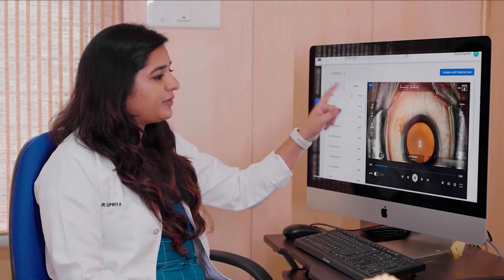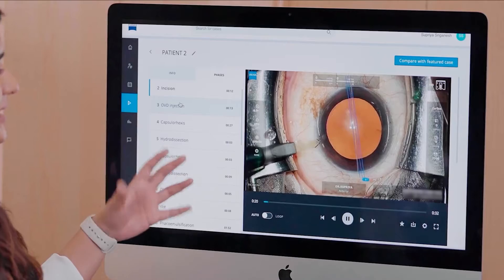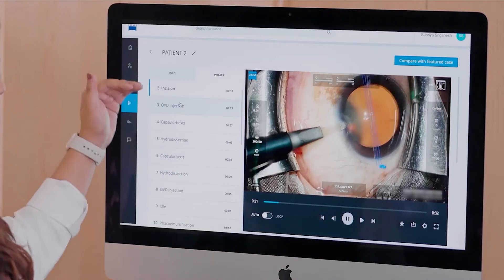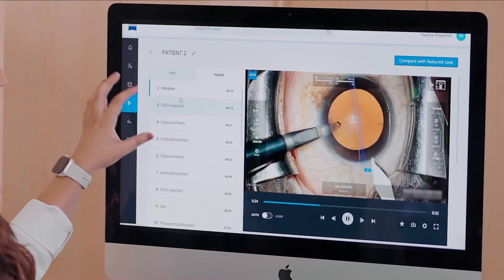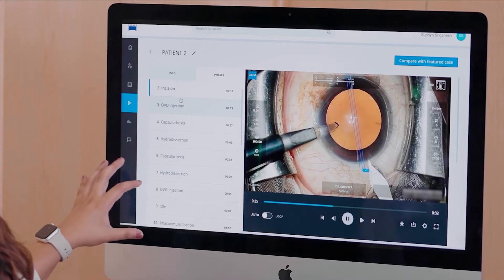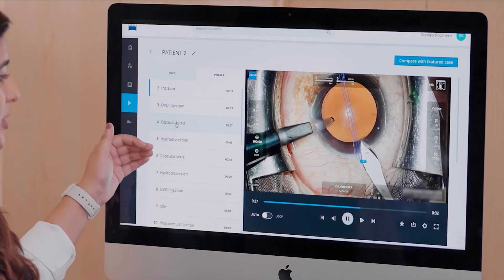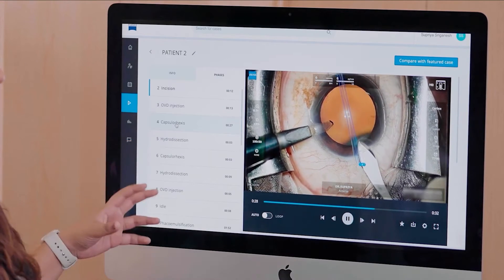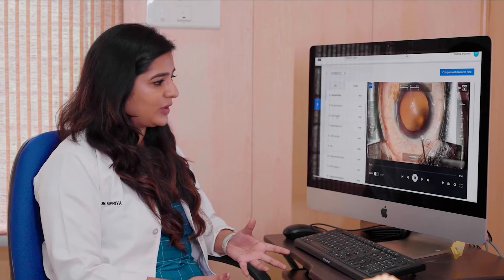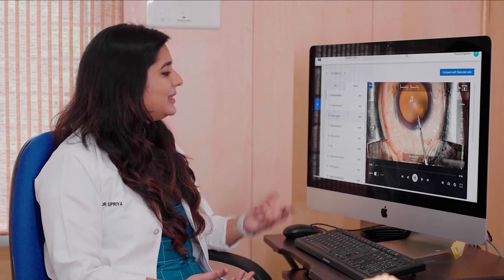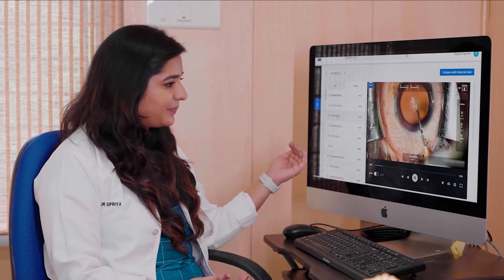When you go into phases, this is where the AI has split the video into the different phases. If you click on any one of the phases — for example, Capsulorexis — it will start playing only that particular phase.